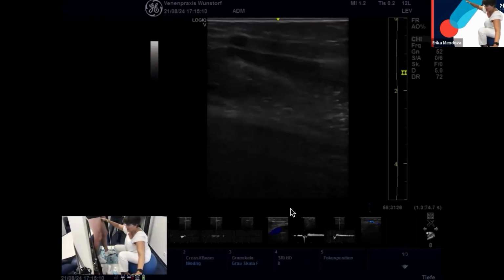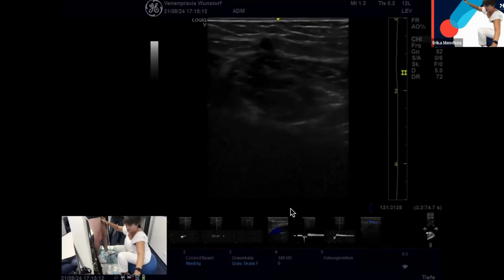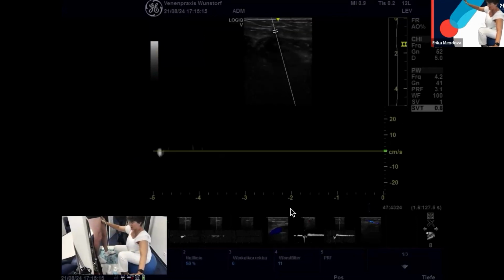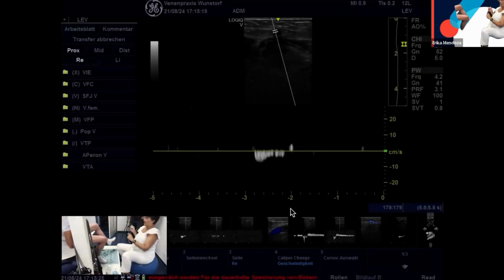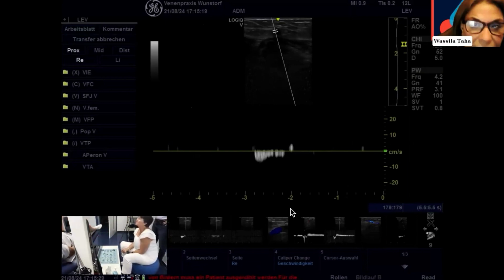The motion of flow is so fine and tiny that I lost it. So we go back there. It looks healthy, but we have not heard it. It's an amazing maneuver.